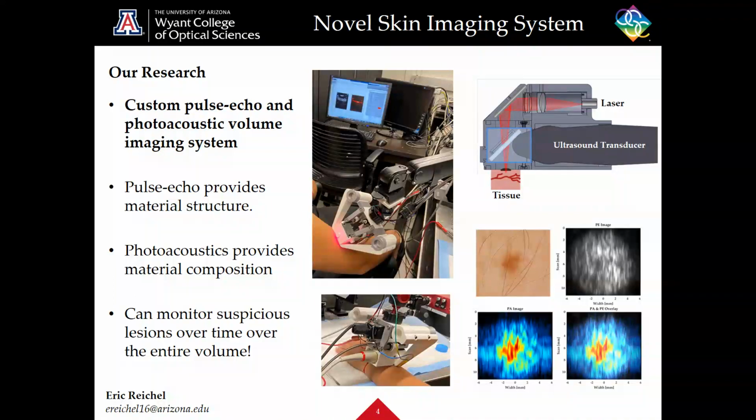Where we are in our current research right now is that we are just finishing up our first in vivo trials, where we imaged a couple of patients to act as our baseline. We looked at just common benign moles essentially, and we're using these as a baseline. We are currently in the process of going from our benchtop system to a mobile system, where we will take this cart-based system to the dermatology clinic where Clara and Delaney work. And we'll be using this system for initial clinical trials to study and ideally monitor melanomas and whatnot.